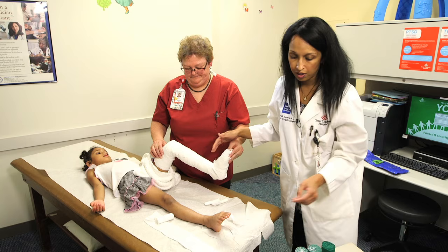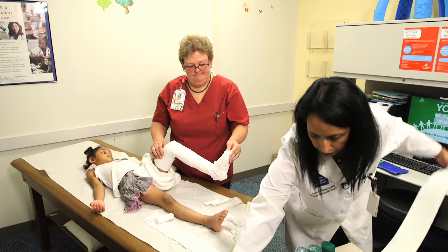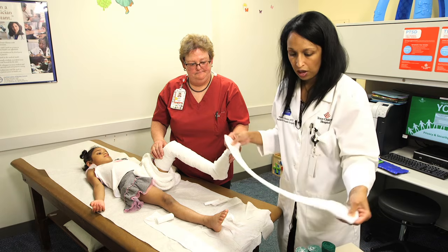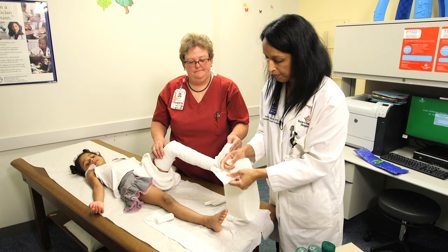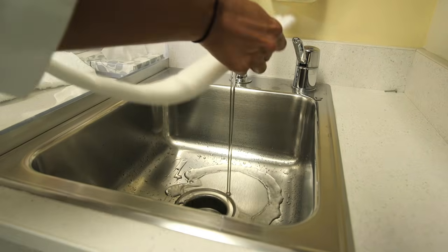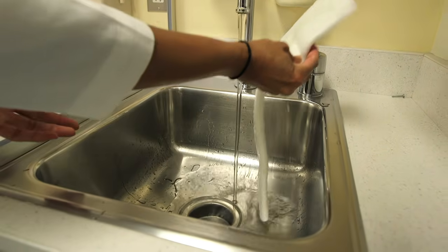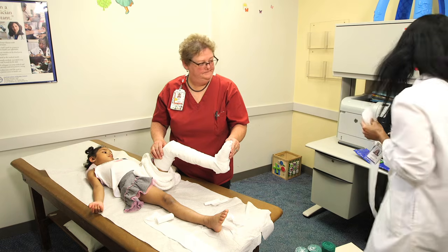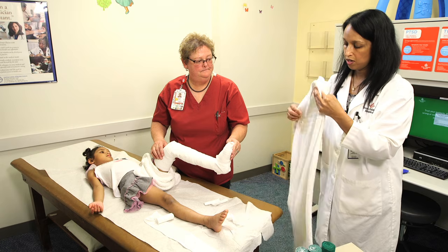So now that we have our nice padding underneath, we have a pre-cut layer of our splinting material. This is fiberglass with, again, another layer of padding over the top. We're going to dip this in water, wring it out with a towel so that it's just damp.